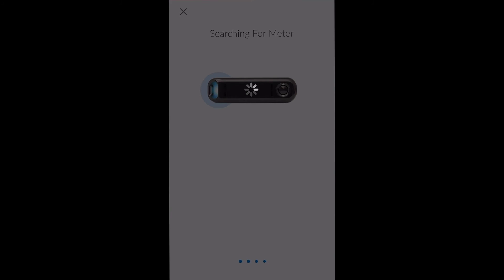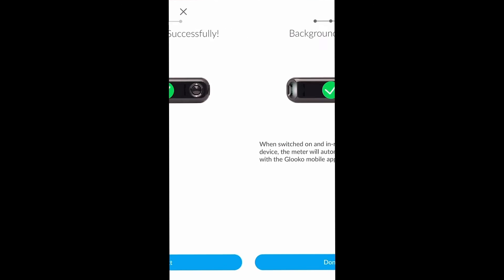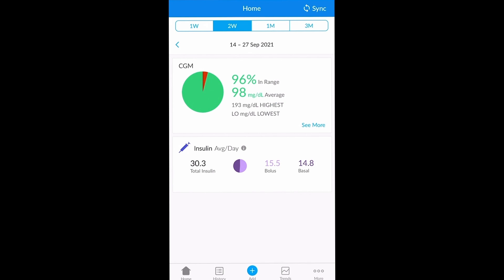Once data has been synced from your device to your Glooko app, you will be able to click Next, then Done. From that point onwards you will be able to find the results within your Glooko profile, and they can be viewed in the various different reports, trends, and also a history of events.